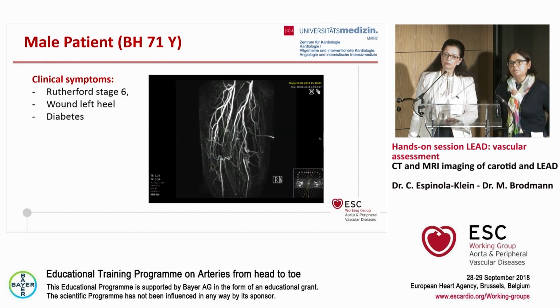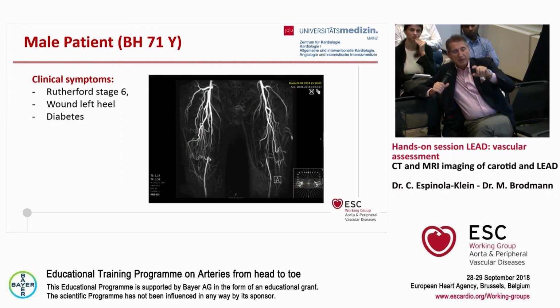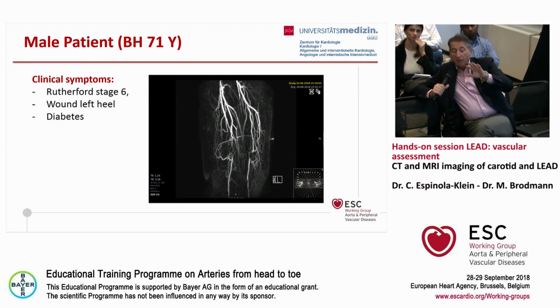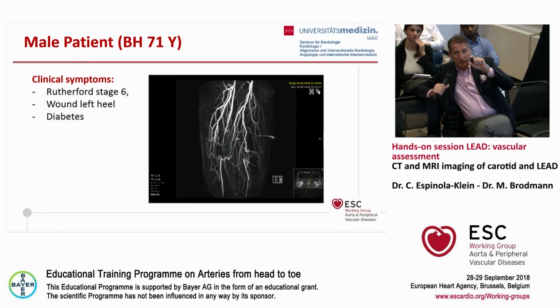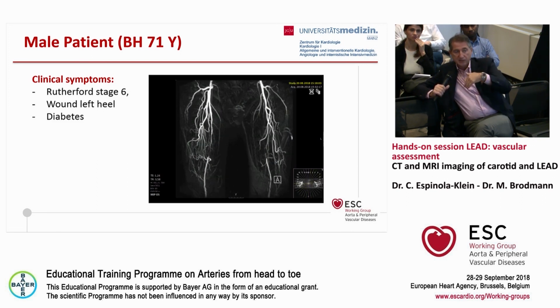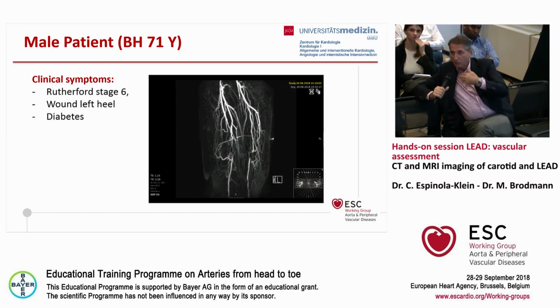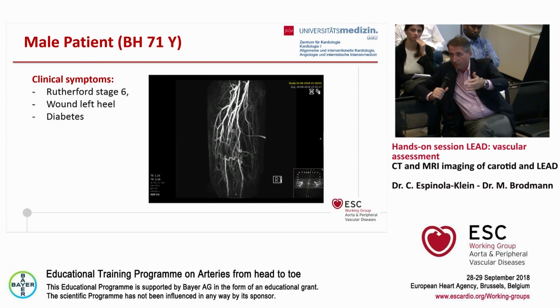Remember that if you perform, for example, I have a very poor MRI facility, so I should do a CT scan. But if I do a CT scan with contrast media, and then I decide that it's better to do an angiography, I can make an overload of contrast media in this patient, although I can use CO2 angiography, for example.